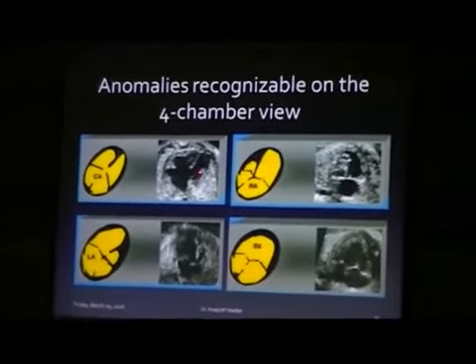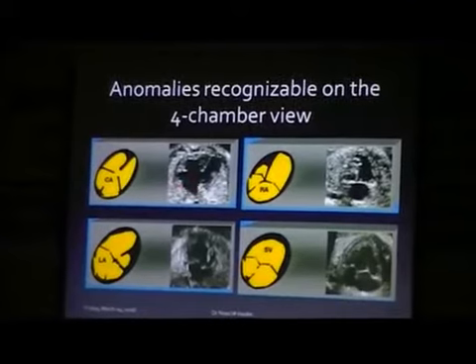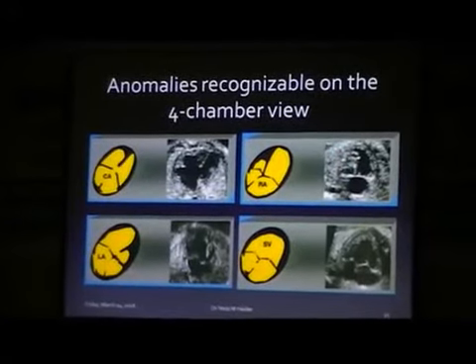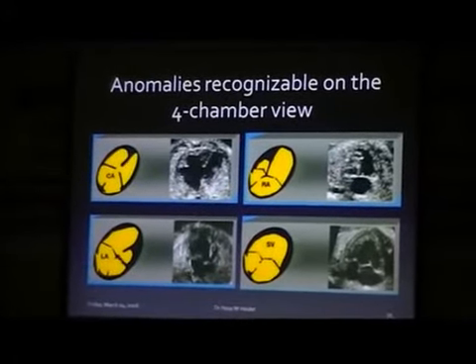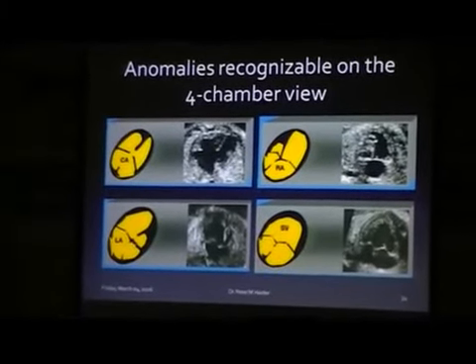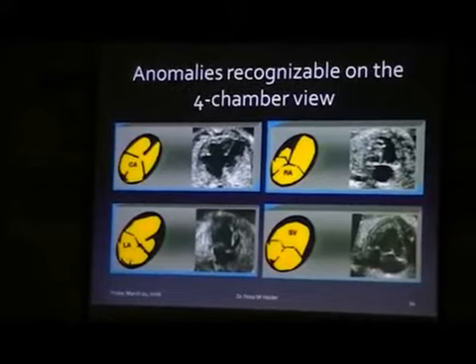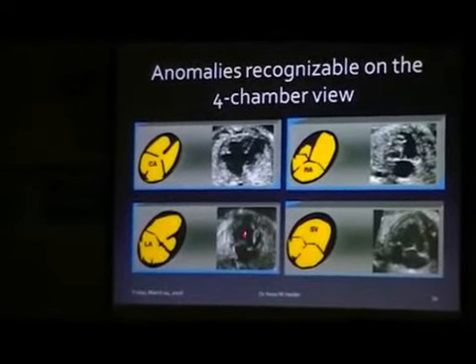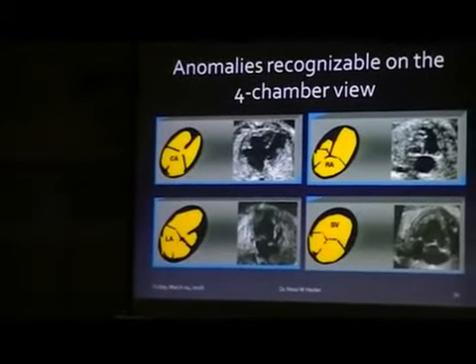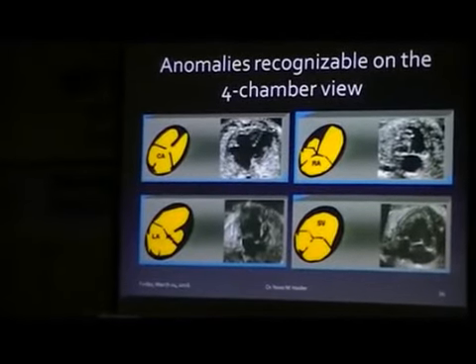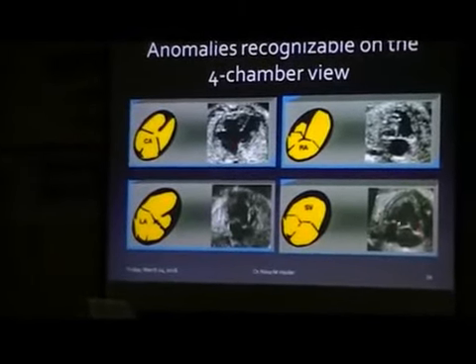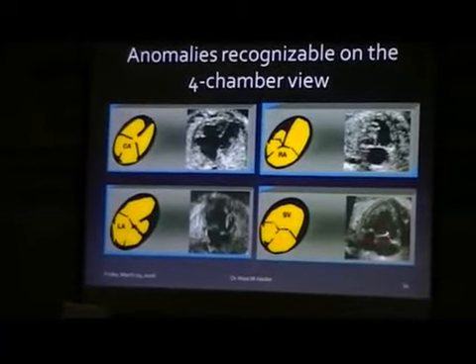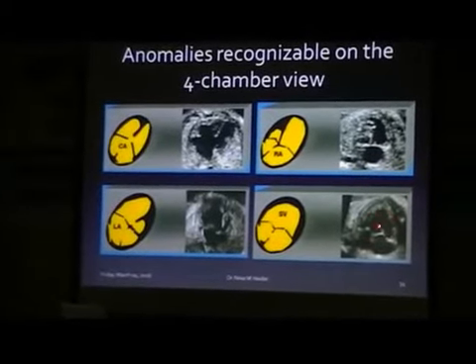This is an atrioventricular septal defect, and there is a common atrium. Here the left heart is small — hypoplasia of the left heart, or hypoplastic left heart syndrome. And here this is the opposite — the right heart is hypoplastic — right ventricular hypoplasia. Here we found a common atrium, and here this is a common ventricle or single ventricle, where the atrioventricular valve opens into the single ventricle.